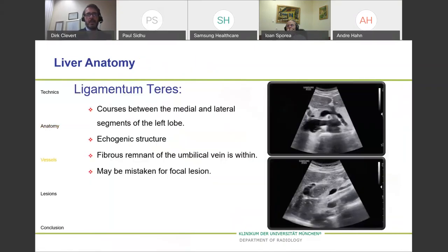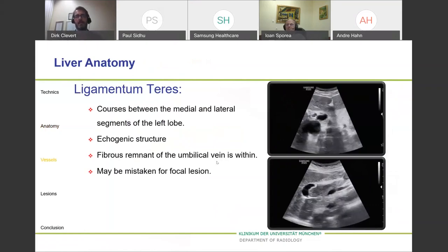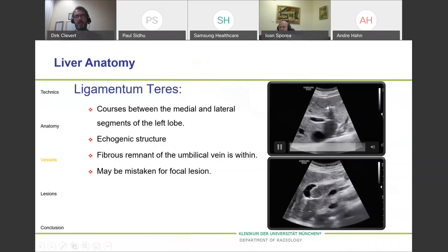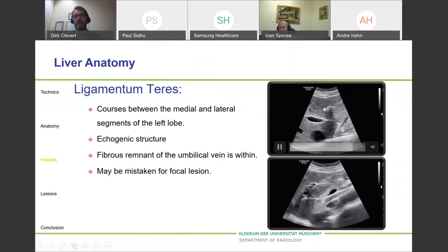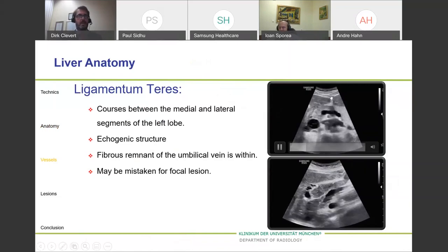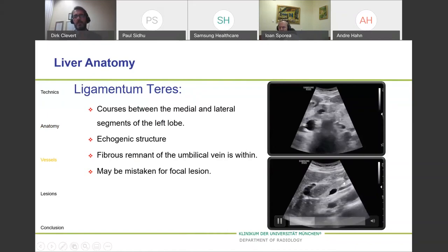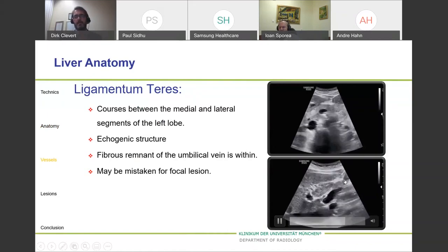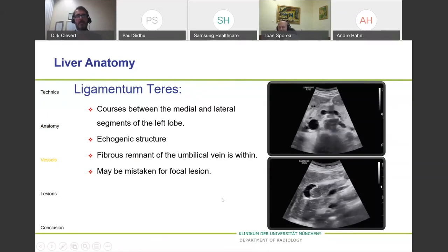There are also important structures in the liver, such as the ligamentum teres. This is the ligament as seen here — it is a hyperechoic structure. Sometimes less experienced practitioners mistake it for a lesion, like a hemangioma. This is the axial plane, and if we shift the probe to the targeted plane, you see the complete extent of this ligamentum. Be careful — that is not a focal liver lesion, that is the ligamentum teres of the liver.